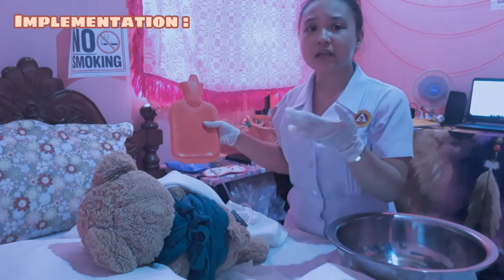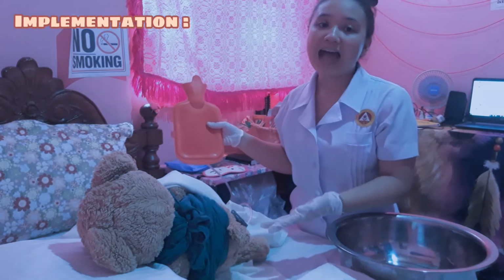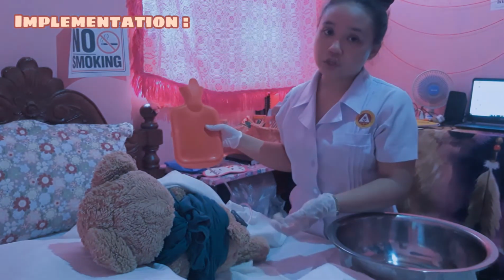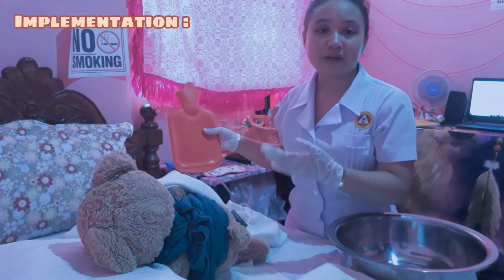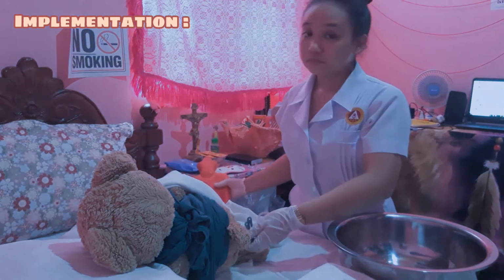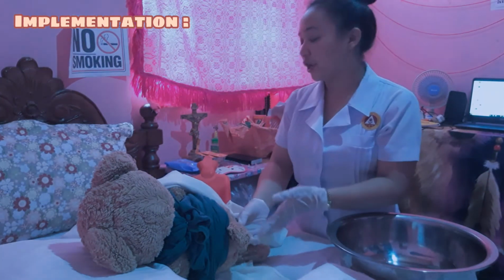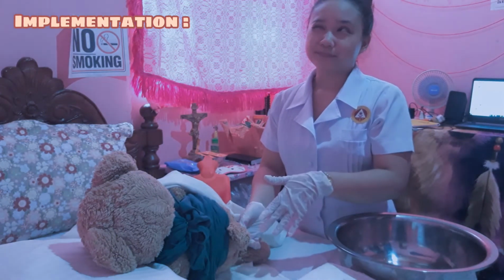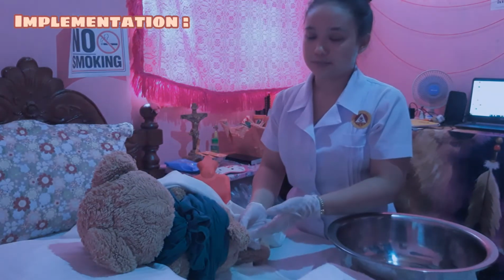During a low enema, hold or hang the solution container no higher than 30 centimeters or 12 inches above the rectum. During a high enema, hang the solution container approximately 45 centimeters or 18 inches above the rectum.